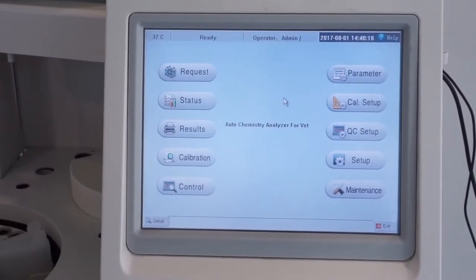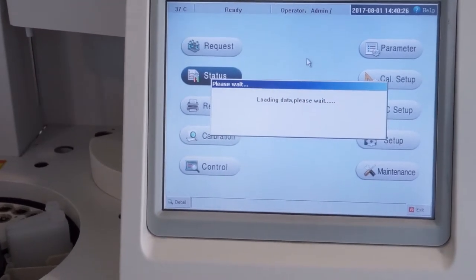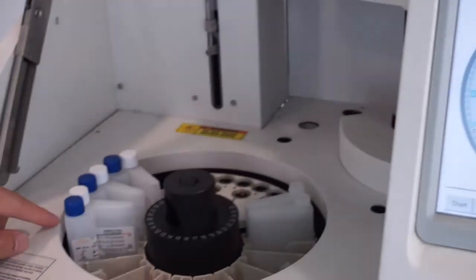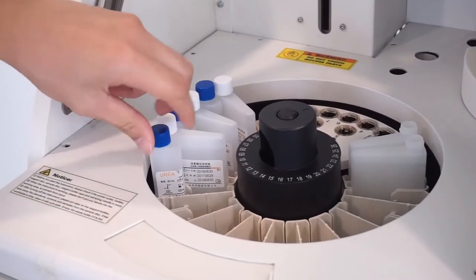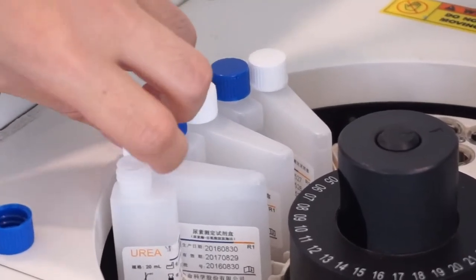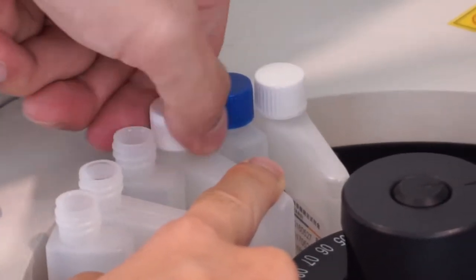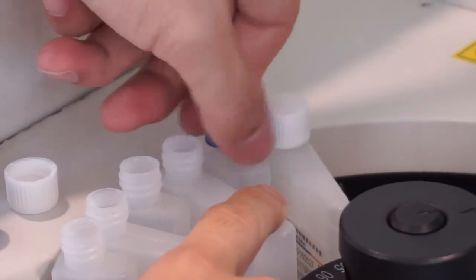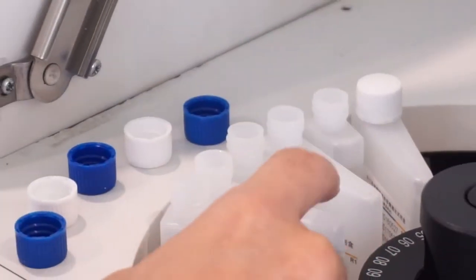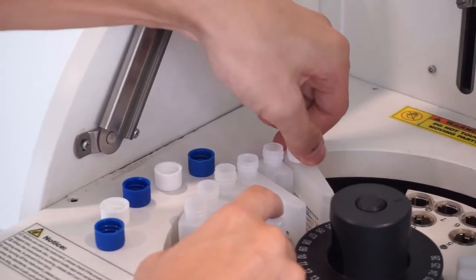After finishing setting up the sample position, we can go to test. We go to the studio for test. But before clicking start to test, don't forget to open the cover of the reagent. Open the cover of the reagent, because we have not opened it. Open the covers one by one. Also, do not mix the covers, because one reagent has one cover. You can make a mark. For example, this is a glucose cover, so you can write down GLU on the cover. Just make a mark.